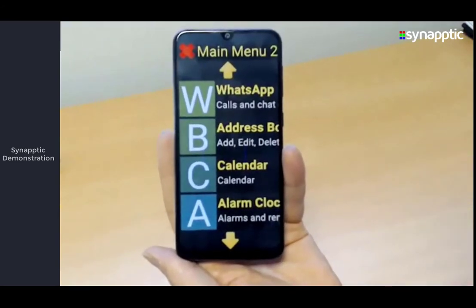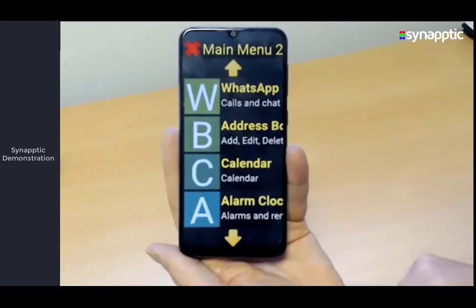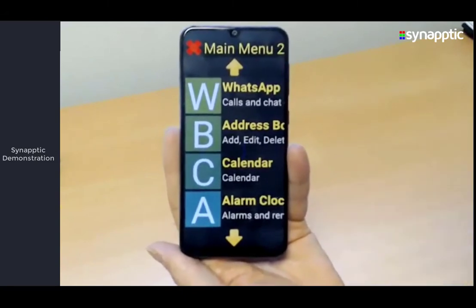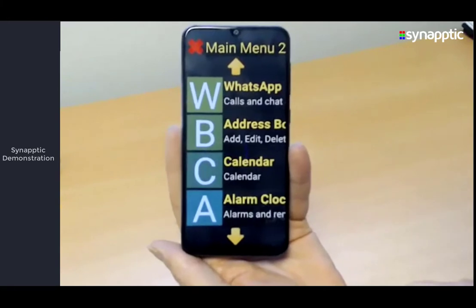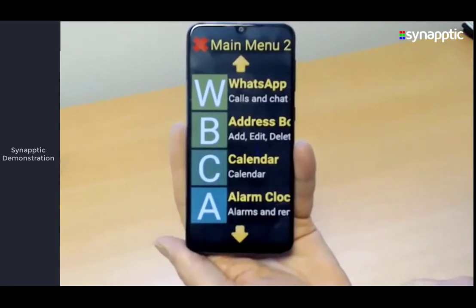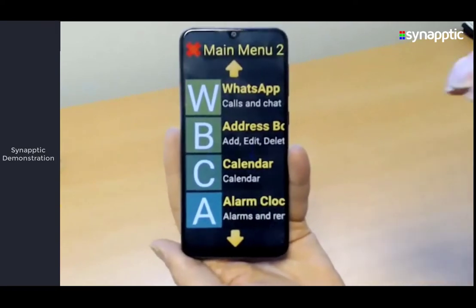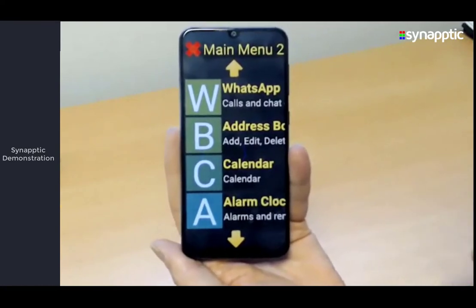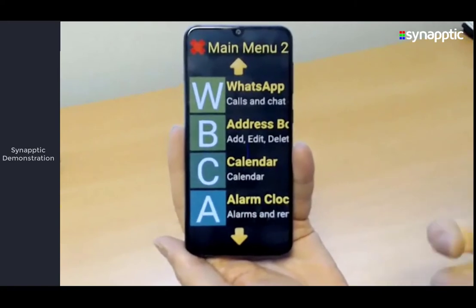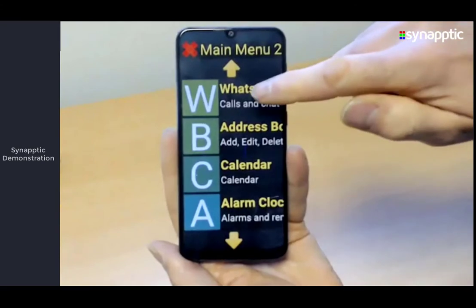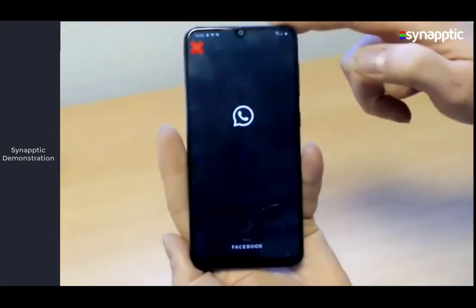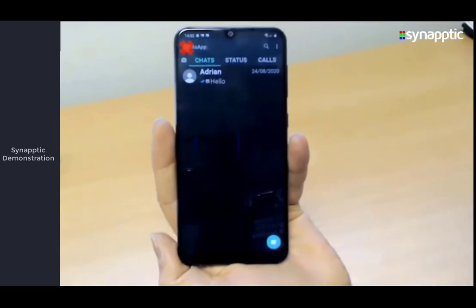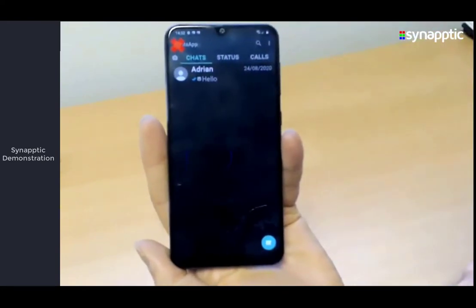The final feature we'll look at in communication is WhatsApp, which is a little bit different. Unlike emails where we can make our own screens for it, WhatsApp requires you to use the WhatsApp app itself. What Synaptic does is automatically detect whenever an app or Android screen is showing and it turns on something called Synaptic Reader, which is basically a voice for the app.